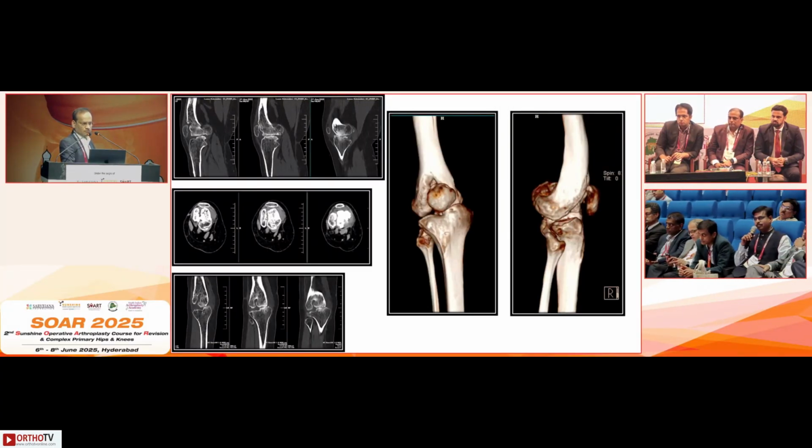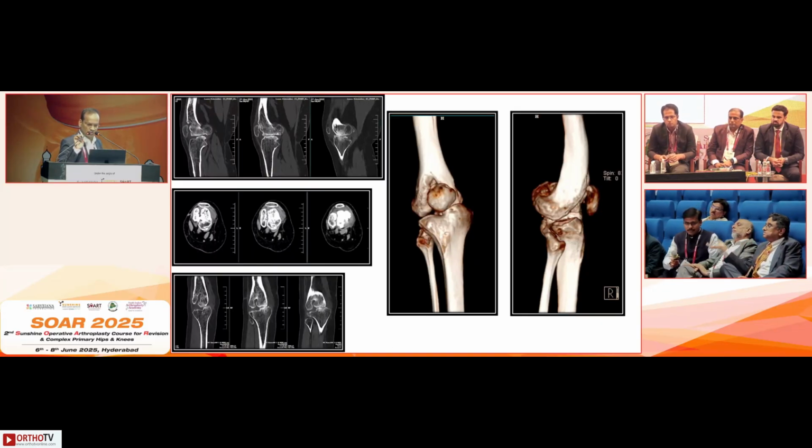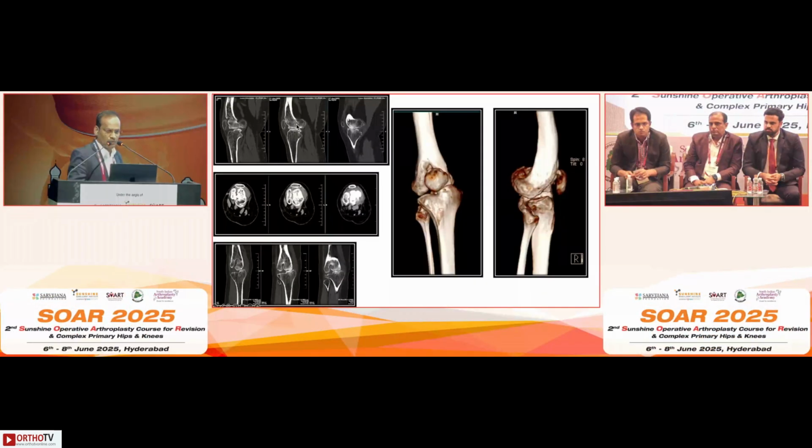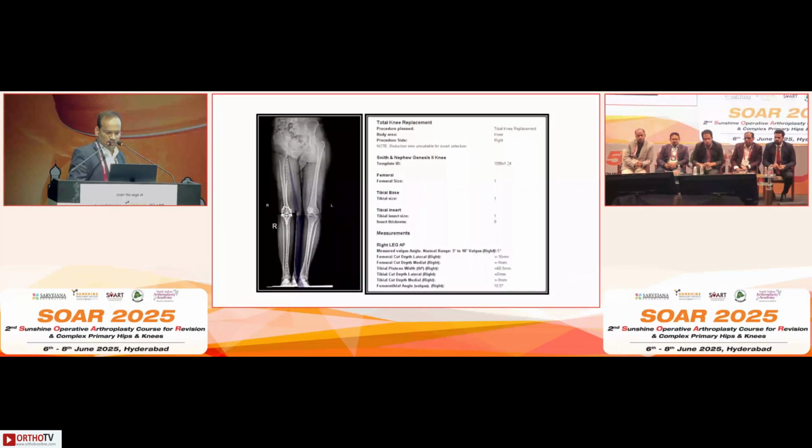Probably you need a technology. You need technology for this part. And also, as we mentioned, there's a significant procurvatum deformity more close towards the joint. So you may not be able to put a stem in this femur. So definitely we have to go with the technology.